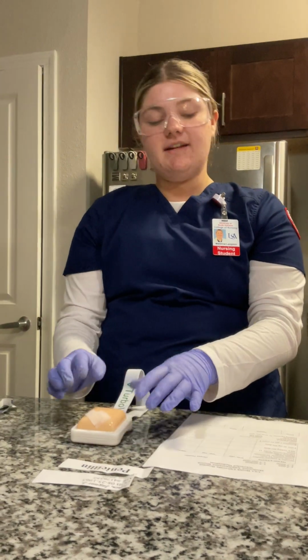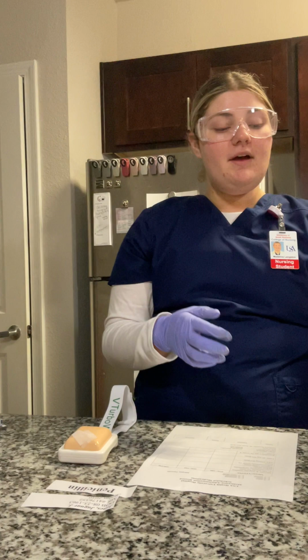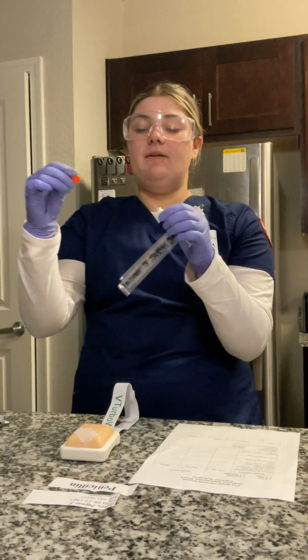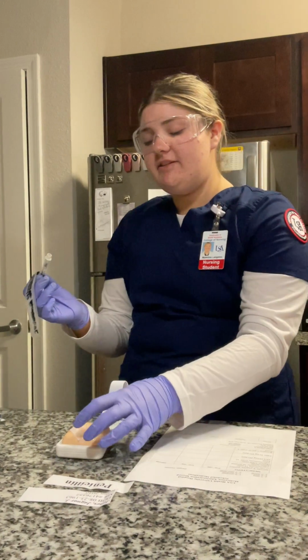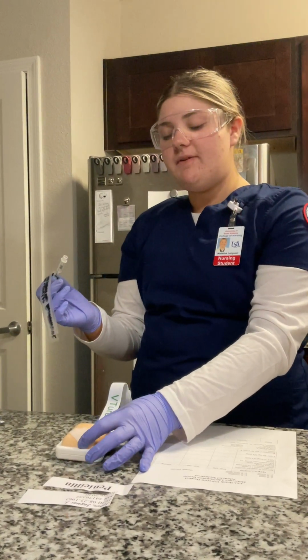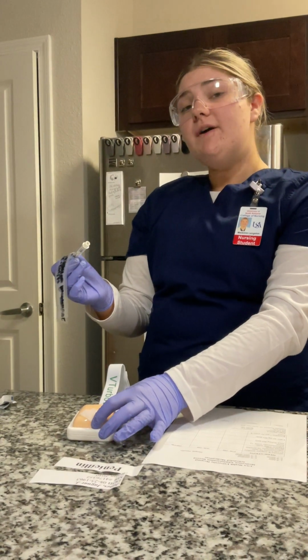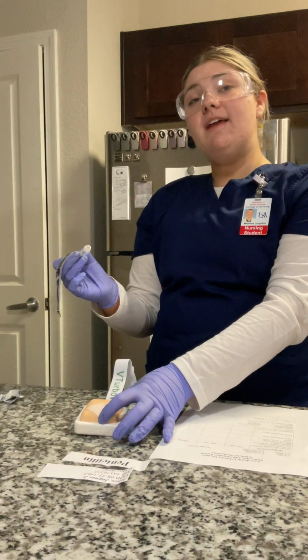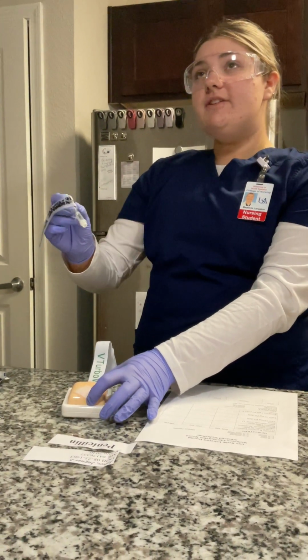So now I'm going to take my syringe, take the lid off and put it in the sharps container. I'm going to pinch the skin, and because I'm only able to pinch 1 inch of skin, I'm going to do the injection at a 45-degree angle subcutaneously, but if I was able to pinch 2 inches of skin, it'd be a 90 degree angle.